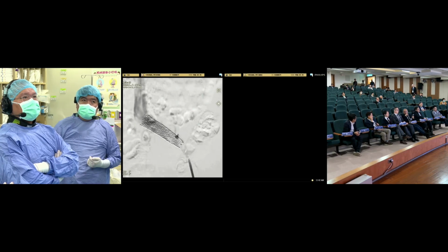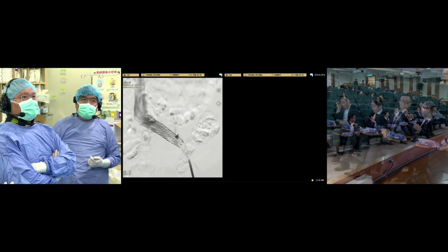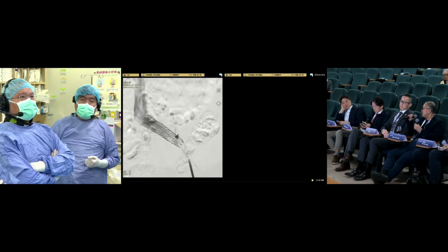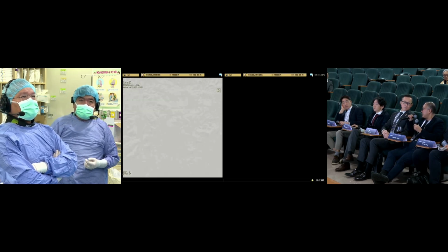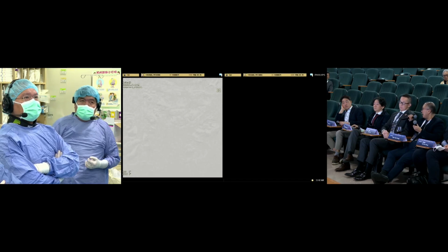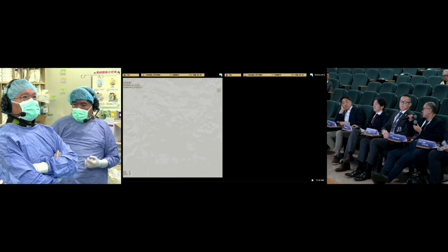If you read the Delphi consensus, there was a big survey done around the world about what different venous surgeons would do. The consensus isn't there, basically. It's completely random what they would do. For me, for PTS, I would definitely go more than 1 year, in agreement with what he said. For compression syndromes, I would give them 6 months to allow endothelialization of the stent.